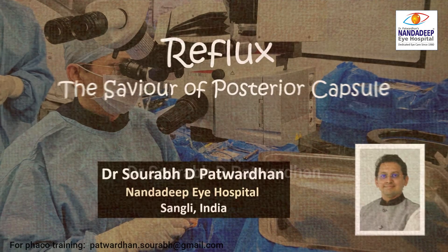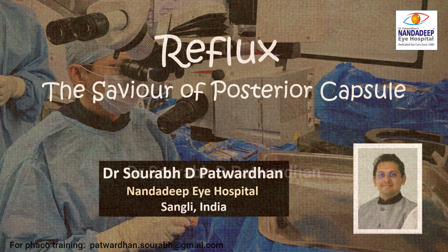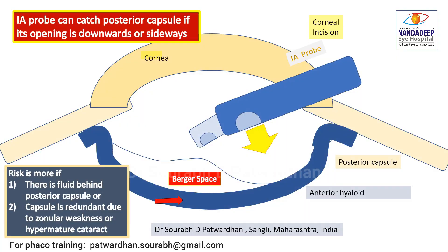In this video, I will be speaking about the reflux which is a savior of the posterior capsule in our cases. The IA probe or FECO probe can catch the posterior capsule if its opening is downward or sideways, closer to the posterior capsule. Many times the reason behind that is a redundant capsule, which may be because of fluid behind the posterior capsule, or in case of an overstretched capsule like in hypermature cataract or zonular weakness.